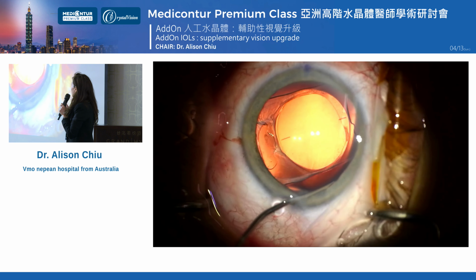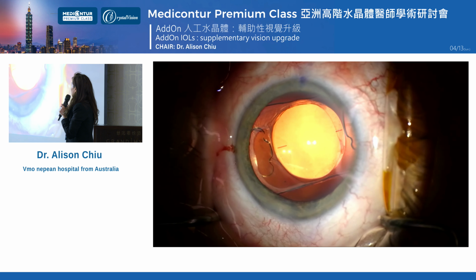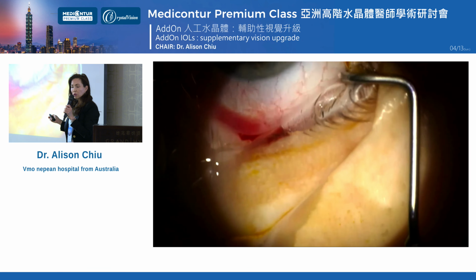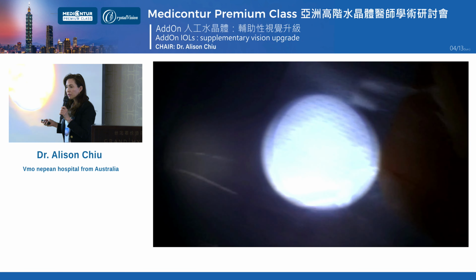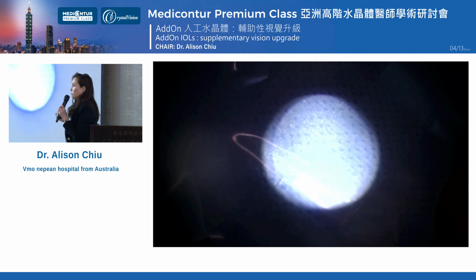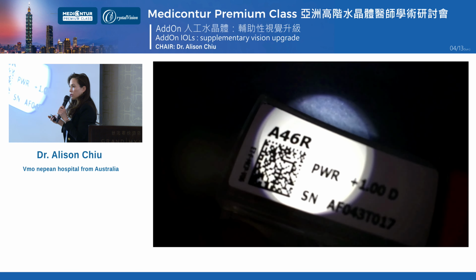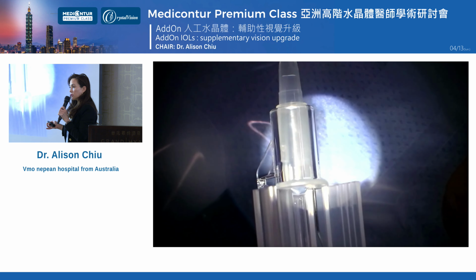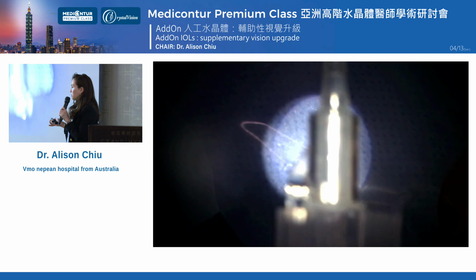This is a patient that just had a residual refractive error, had an EDOF of a different platform in both eyes, and had their surgery done elsewhere but wasn't happy with the reading vision. So she tolerated mini monovision very well.